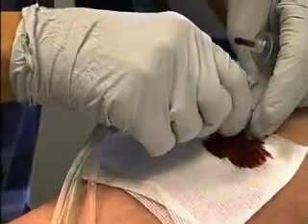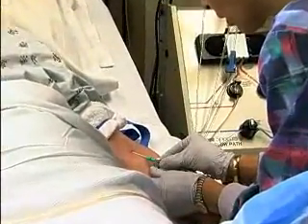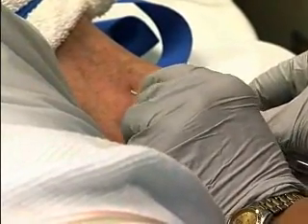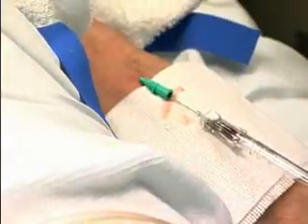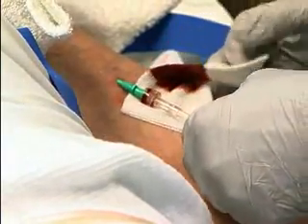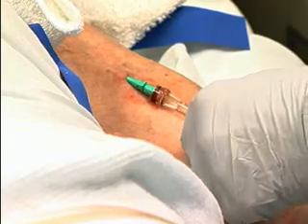For venous access, for the outflow, we use a 16 gauge angiocatheter, and that is used to puncture the vein, and the catheter is gently introduced into the vein and the needle is removed. The access tubing side is attached to the catheter for the blood to come out. And usually with this venous access, we get a flow of about 80 to 90 cc's as well.